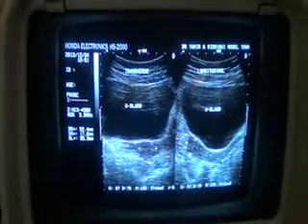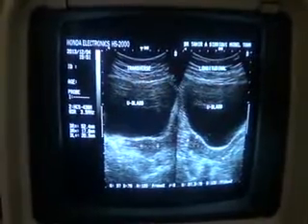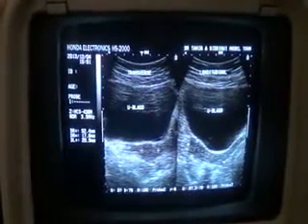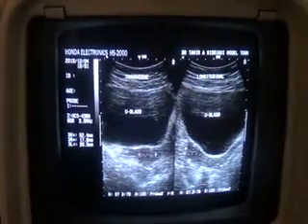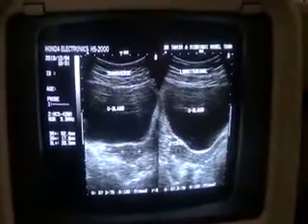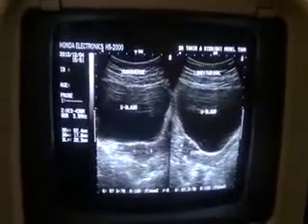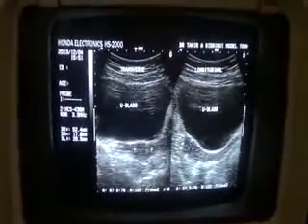This is a gynecological ultrasound of a one-year married female. She did not conceive during this period, and the reason for not conceiving is the hypoplastic uterus. This is the uterus in longitudinal section measuring 5.2.